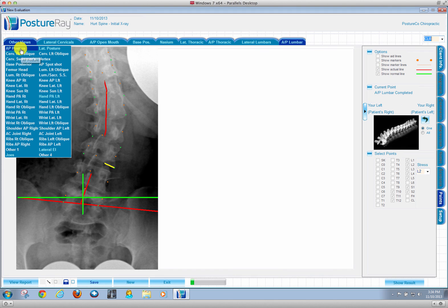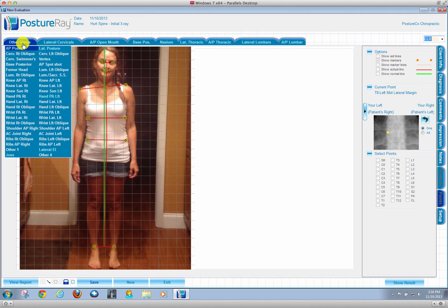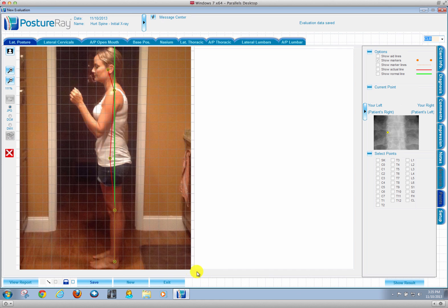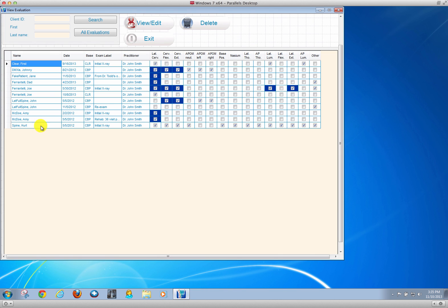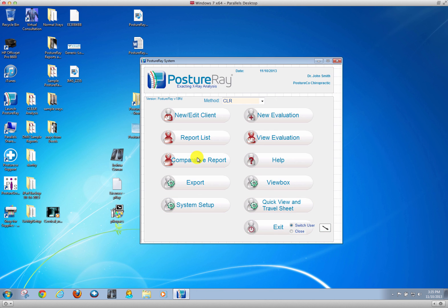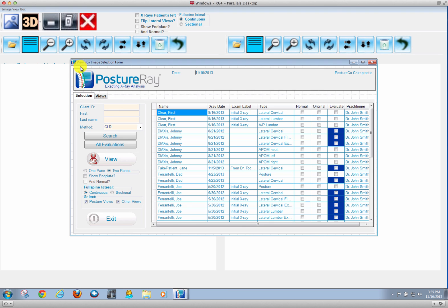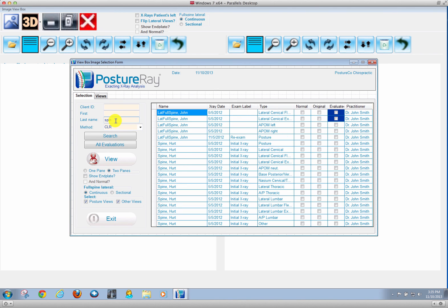We can even load postures for reports of findings. If we're going to do a report of findings on this patient, it's as simple as going back to the main menu, we're going to do a view box, pull up that patient, their last name was Spine, and highlight them.